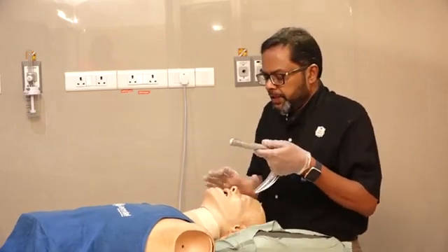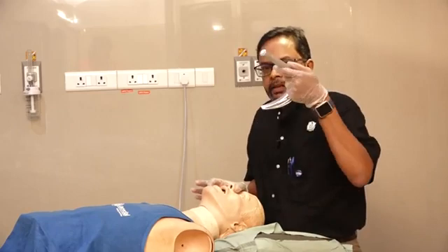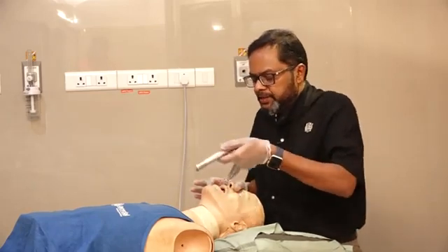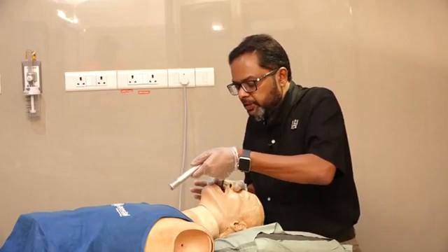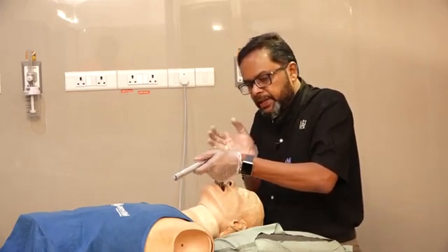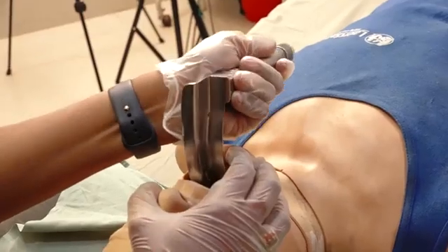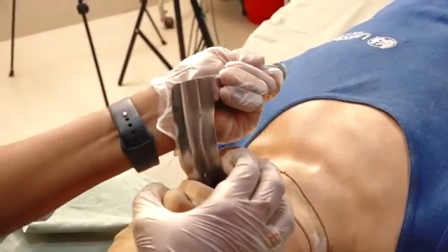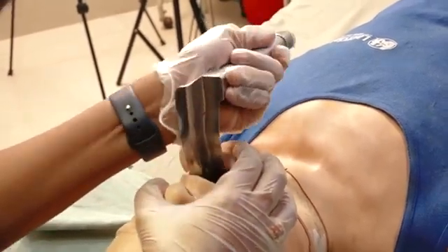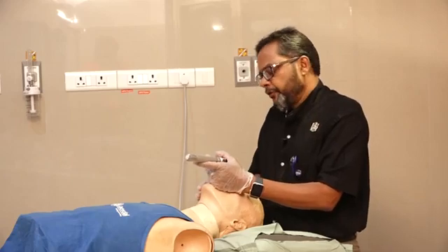After positioning correctly, insert the laryngoscope blade through the right side of the tongue — not the left side, but the right side. While inserting from the right side of the tongue, the tongue will automatically shift to the left side. Then gradually bring the laryngoscope blade into the midline and advance until you see the tip of the epiglottis.